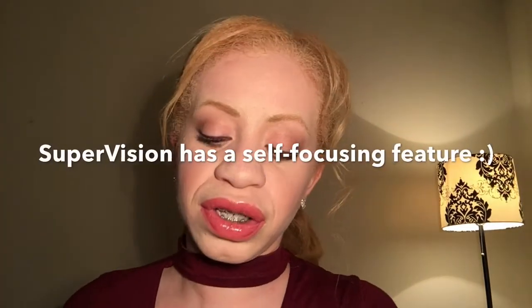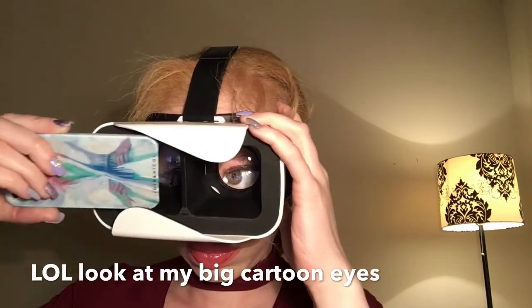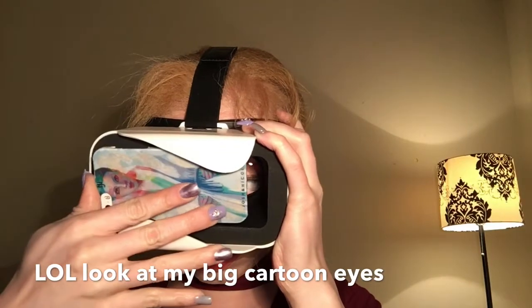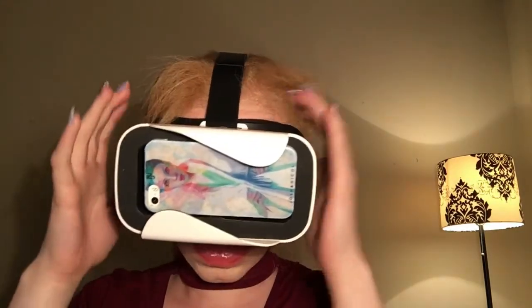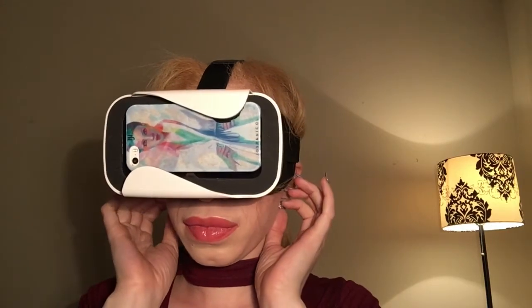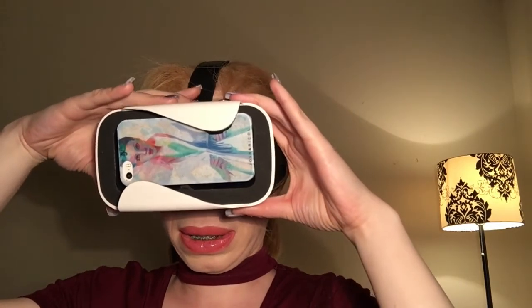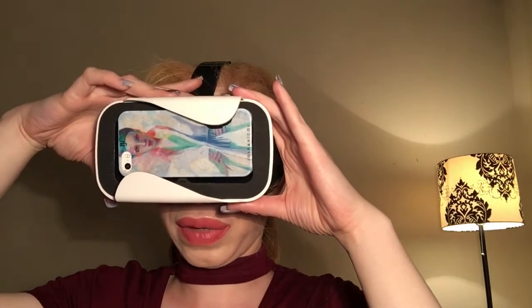The only thing I'd be concerned about is that once the phone is in there, you cannot adjust the magnifier on the phone, so the best way to do this would be to adjust it prior to putting it in. I did read somewhere that Supervision self-adjusts, so I need to find out more about that. I've got a good fit here — it's pretty comfortable around my face and around my nose. I need to move the eyes all the way in for my eyes. Wow, I can see a lot of detail!